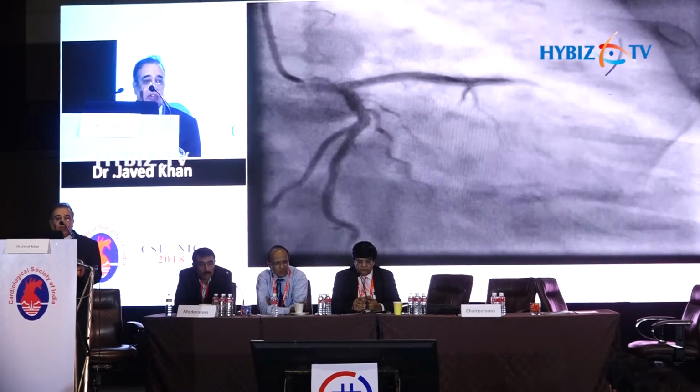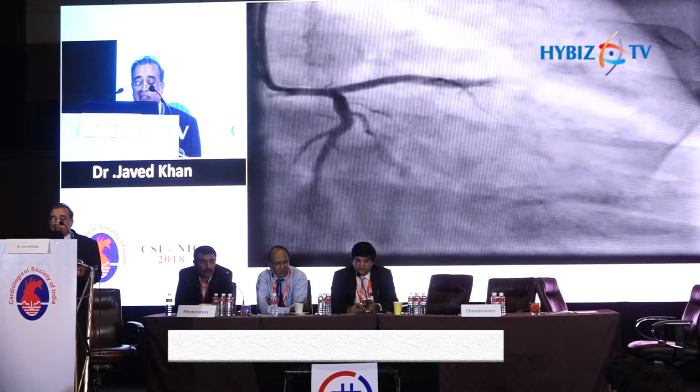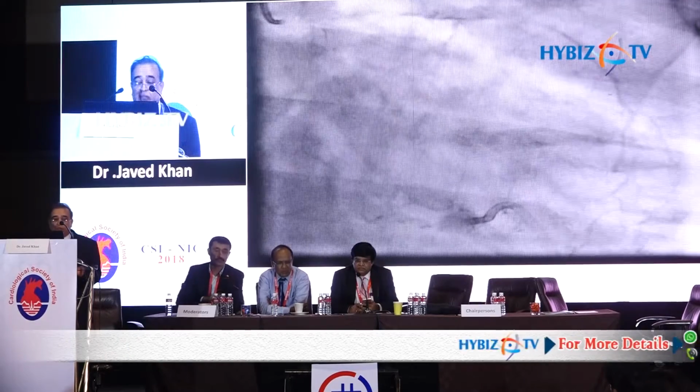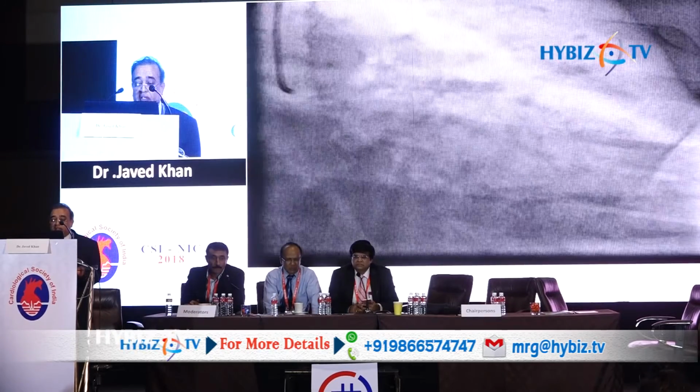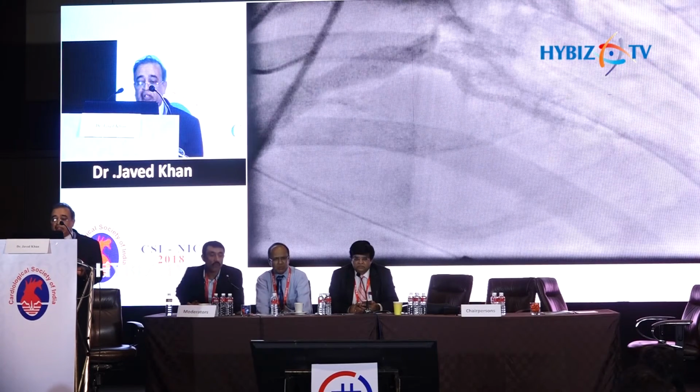But shockingly, epicardial vessels were all normal. There is nothing which suggested that the patient has a perforation in the coronary artery. The LAD was normal. The twig in which the wire was there is also normal. The circumflex is also normal. So we have taken a couple of shots of the coronary, thinking we were missing something somewhere. Nothing could be found.